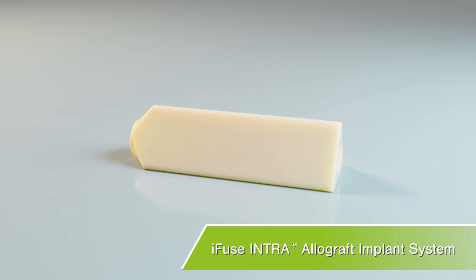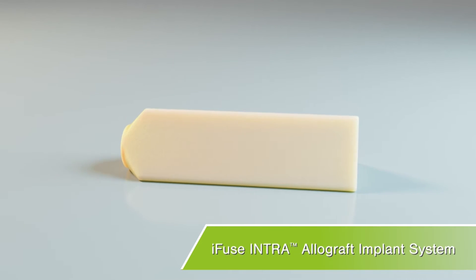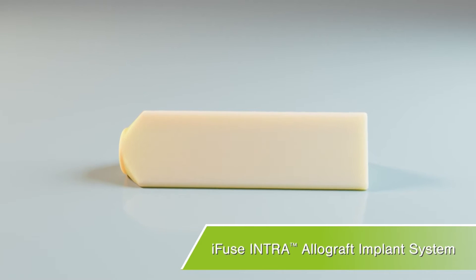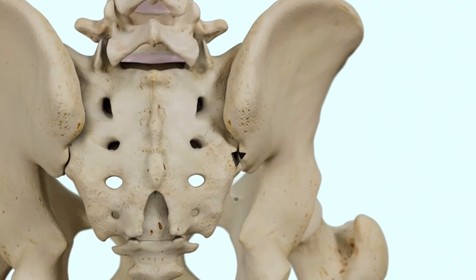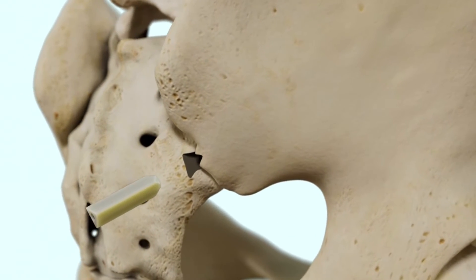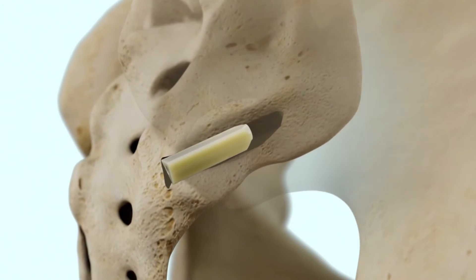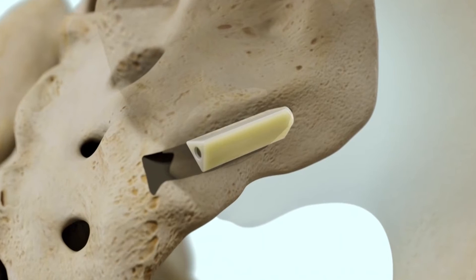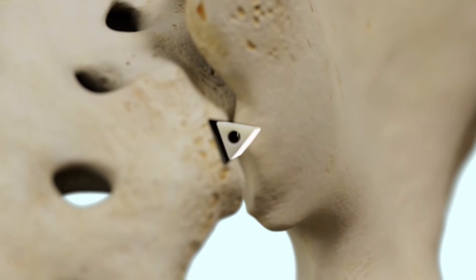The iFuse intra-allograft implant system was designed for SI joint stabilization and fusion to relieve pain caused by SI joint dysfunction. Through a small 2 centimeter incision in the lower back, a small triangular allograft implant is inserted through a soft tissue protector into the SI joint. The allograft implant is designed to provide immediate stabilization and promote SI joint fusion.